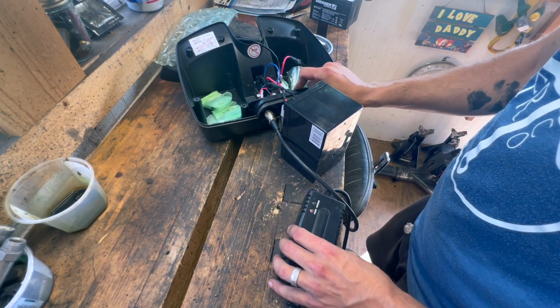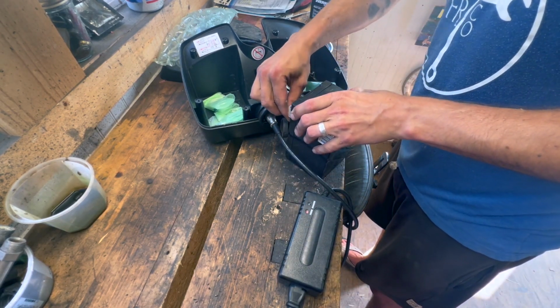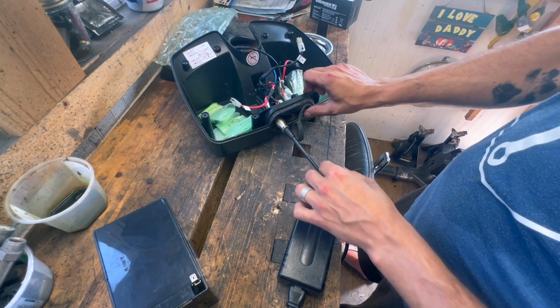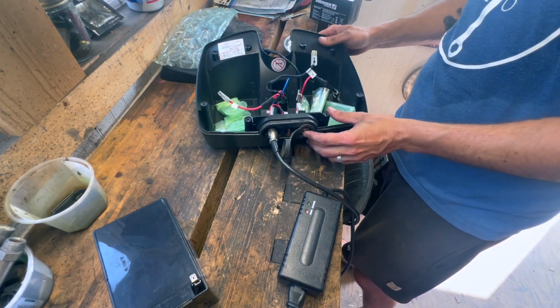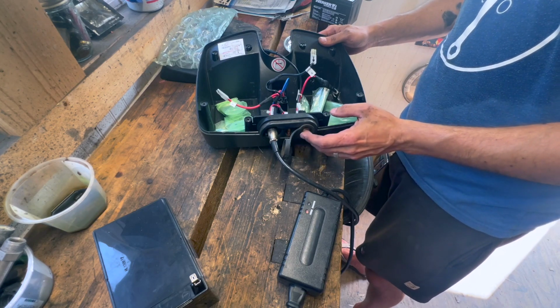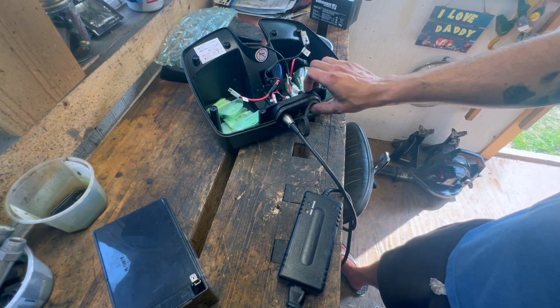Okay, we got power, but still not charging. Like, this switch doesn't really seem to do anything. I mean, I'm sure it does something, but the switch itself doesn't click or have any detents. I'm not sure what the purpose of that would be, unless it's just to turn the batteries on and off.